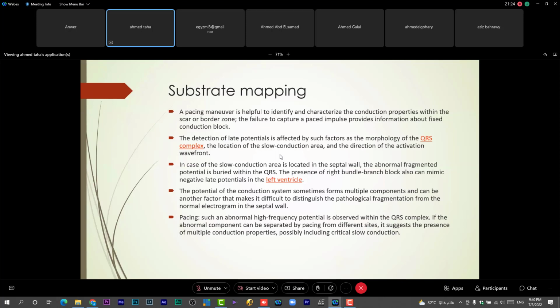Sometimes these can be potentials for ablation, especially, for example, in an extrasystole coming from this area and inducing the tachycardia itself. So they are not always potentials you don't ablate. Sometimes you need to ablate them if you think these potentials are the origin of the extrasystole that can induce the ventricular tachycardia. And this time you will do extra stimulation from this area to reproduce the QRS complex morphology of the PVC that was documented during the tachycardia itself or during the Holter study.